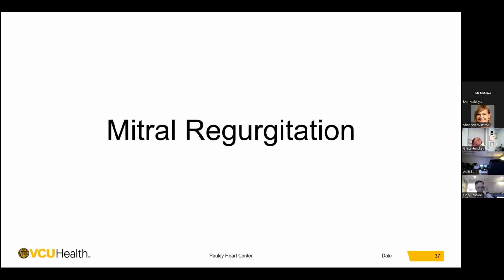Before I talk about mitral regurgitation, I need to make note that MRI in mitral stenosis is limited, and the gold standard is still echo or transesophageal echo, as we don't see the valve as well as we see it in echocardiogram. Echo can also help us guide treatment or monitor intervention like balloon valvulotomy. But MRI can perform very well in mitral regurgitation.